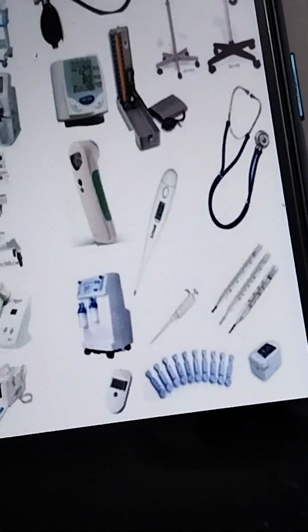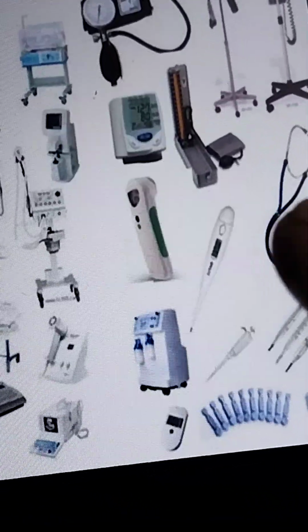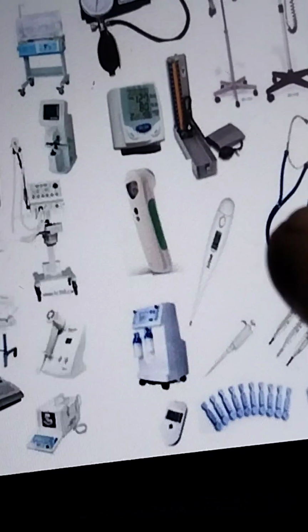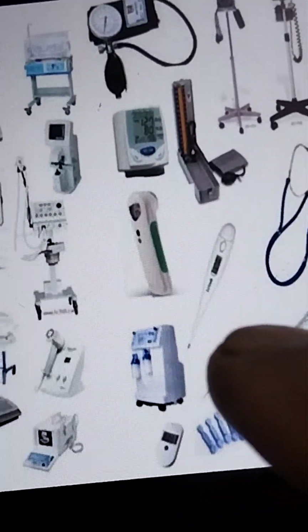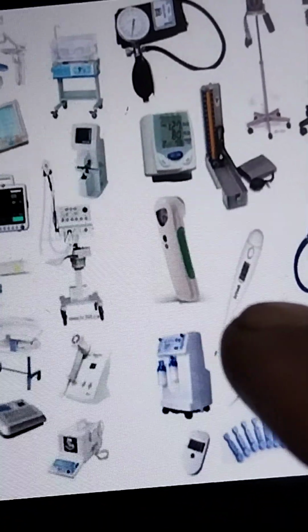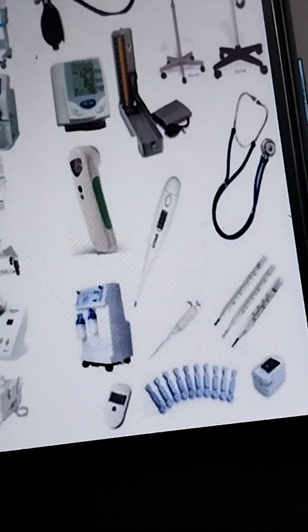Although the use of flammable anesthetics is not common today, it should be recognized that many of the medical gases currently in use, such as oxygen or nitrous oxide, vigorously support combustion. Wherever there is an elevated concentration of such gases, there is an increased risk of fire initiated by electrical faults.